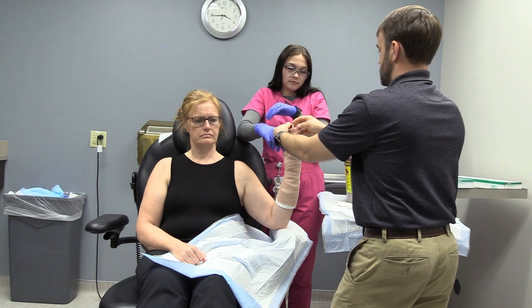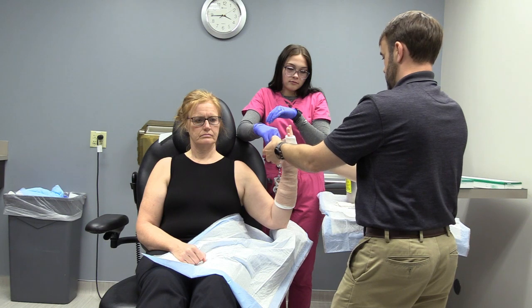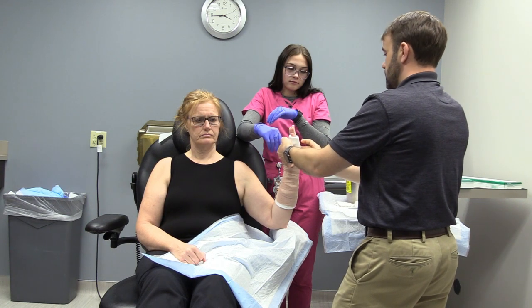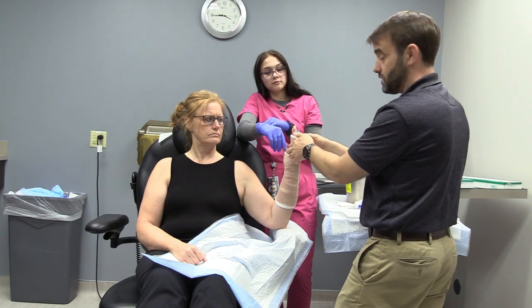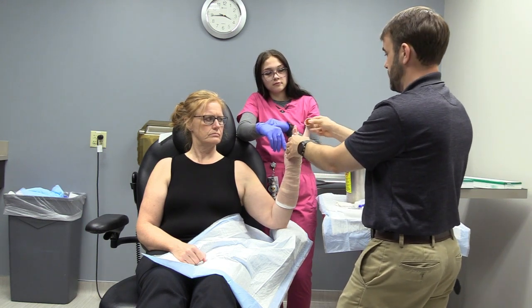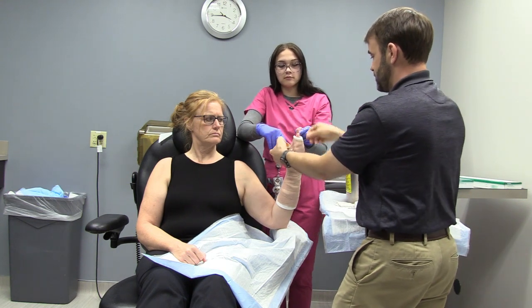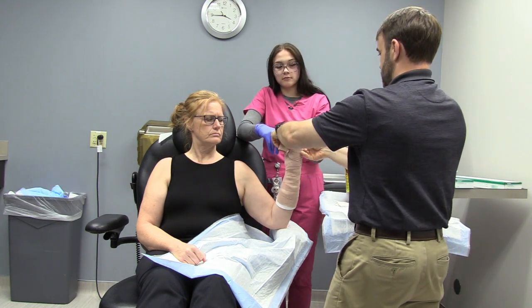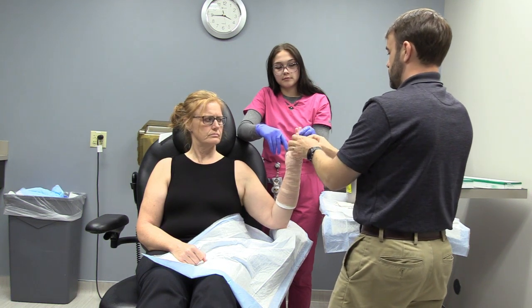Then getting through the fingers can be a little tricky if somebody's in a lot of pain, but usually they do pretty well with this. You can also, at this point, abandon the larger roll and switch to like a 1-inch roll. I'll do that sometimes with people with smaller hands. And in your case, I could have done that, but it'll be okay. Make sure the Coban's back a little bit from the padding so you can see the edge of it pretty well.